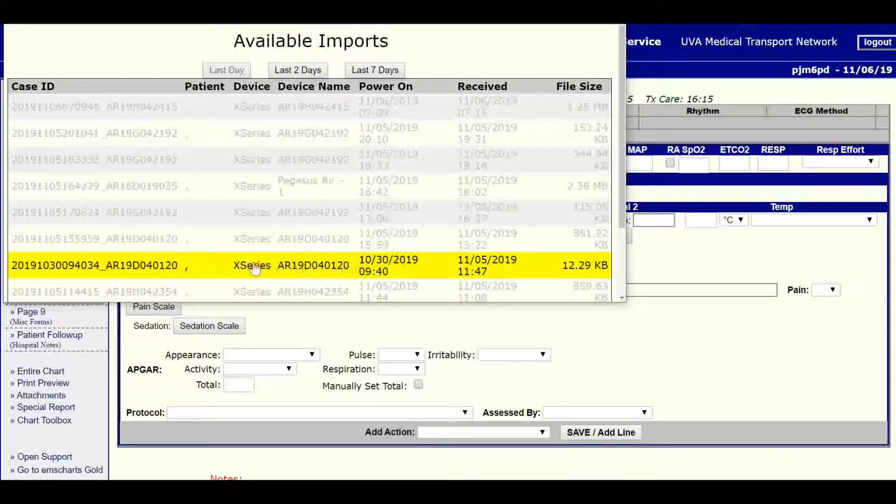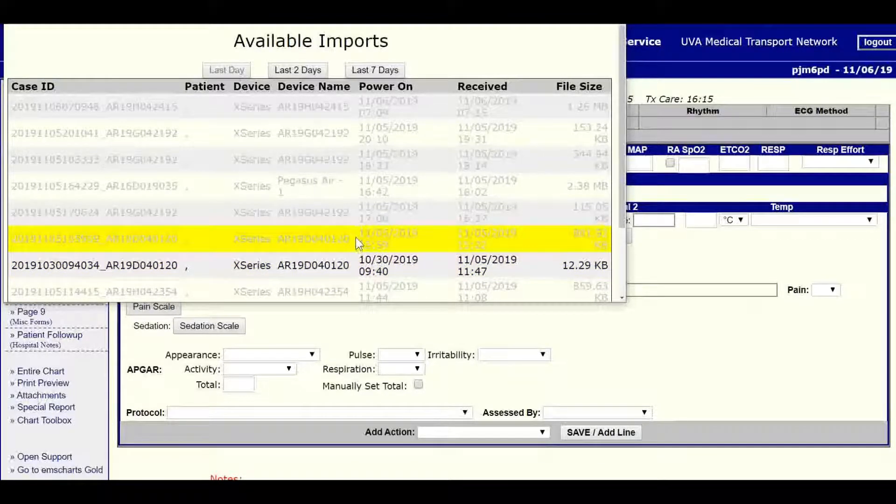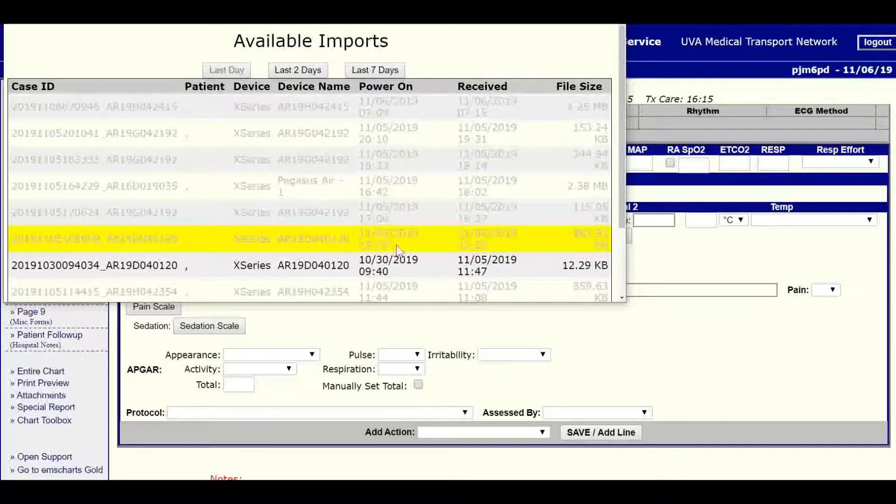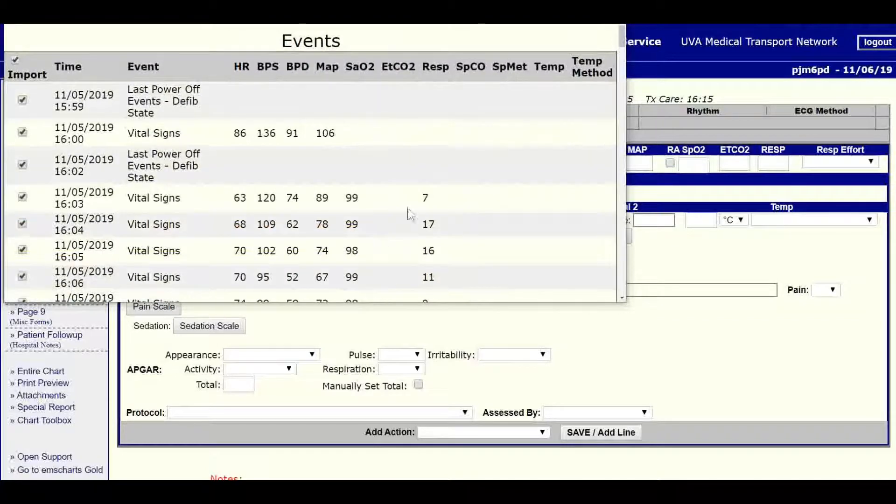You'll see the device number, the patient name if inputted, and the power on time for the Zoll Monitor. Here we see the one that corresponds to our 1559 on scene time, so we're going in here.